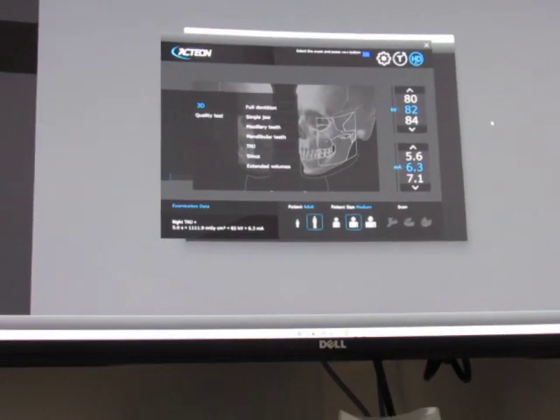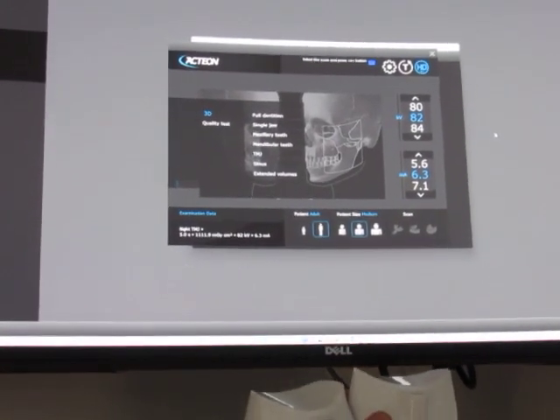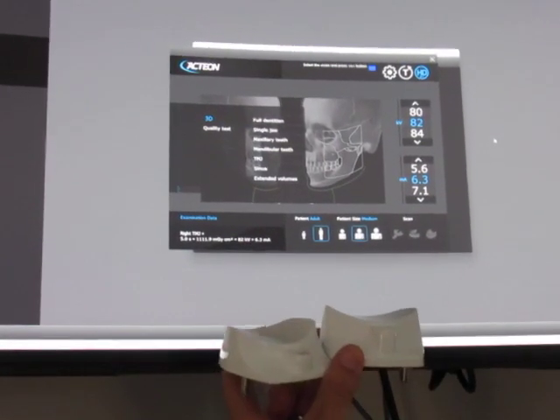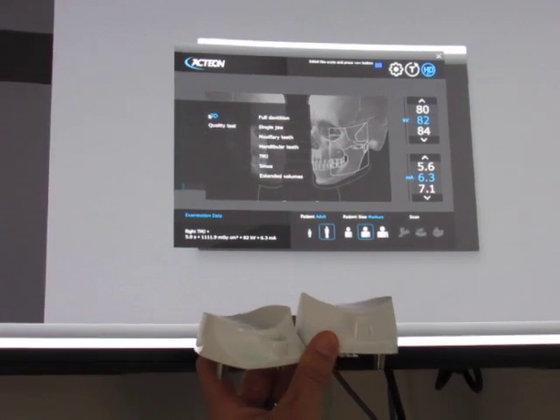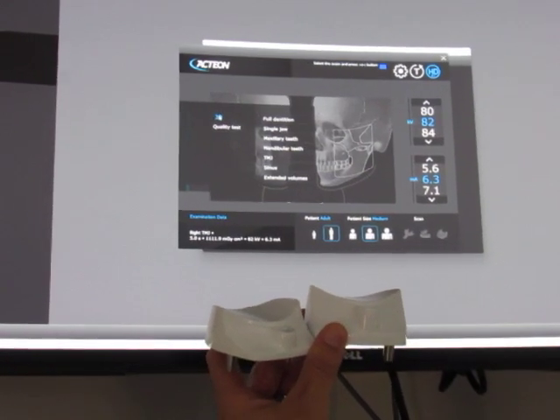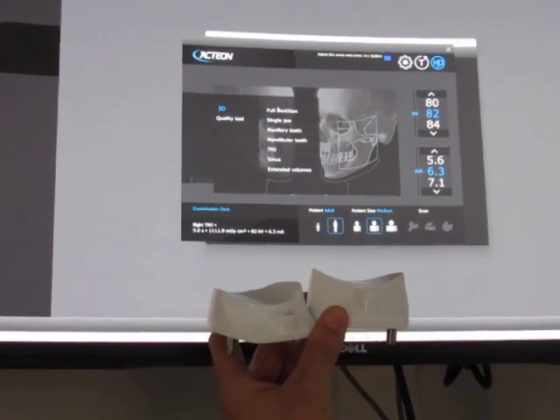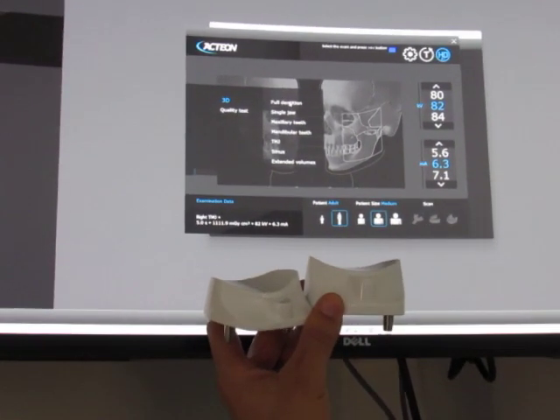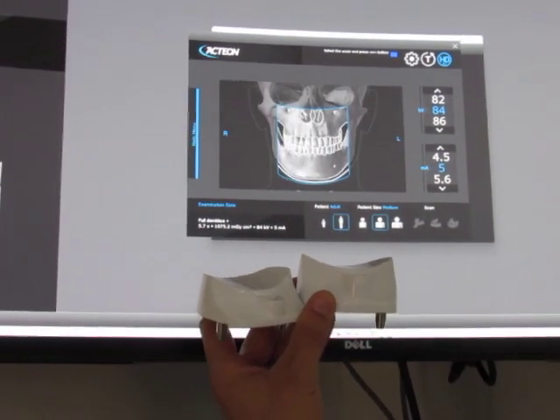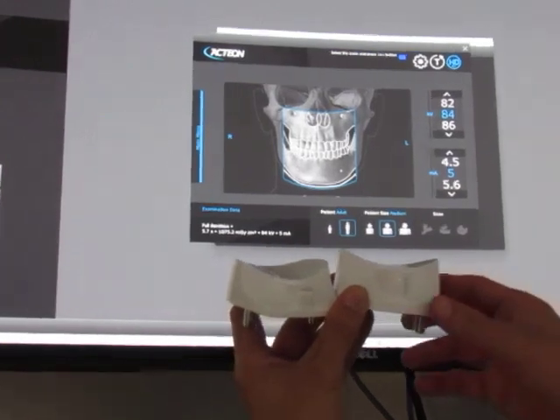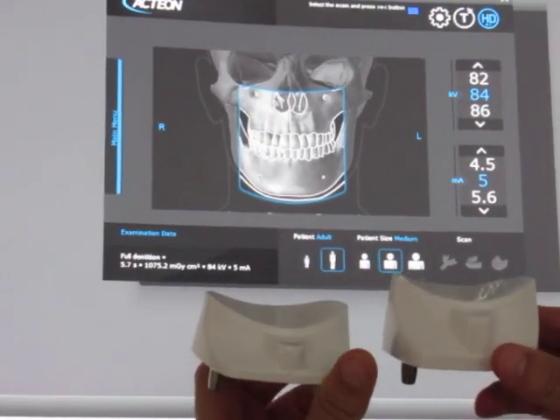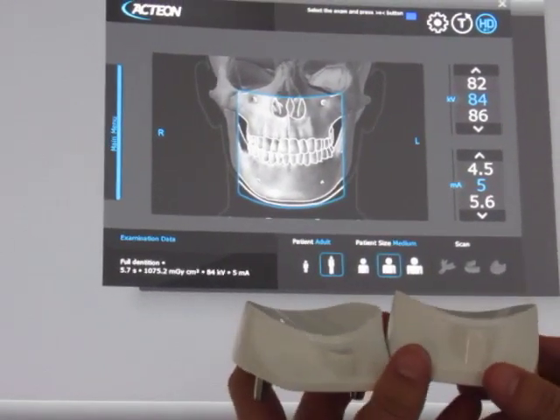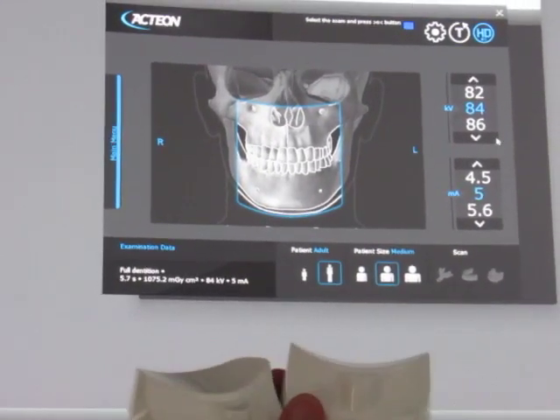This video is to demonstrate which 3D chin rest to use with your 3D exam. For full dentition, which is your 9 by 8.5 exam, you are going to use the medium or large chin rest.